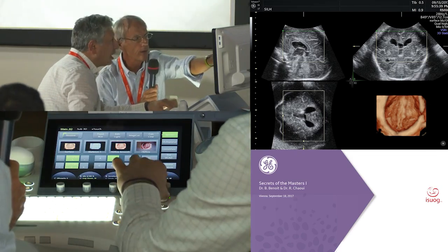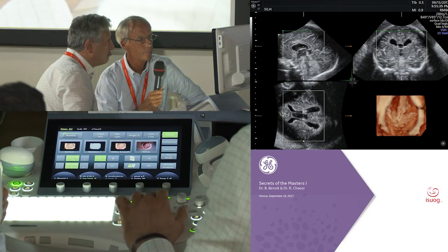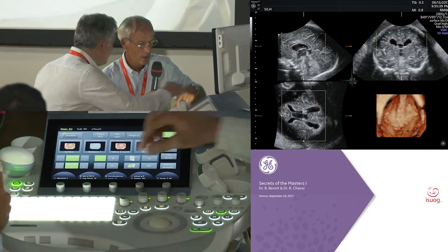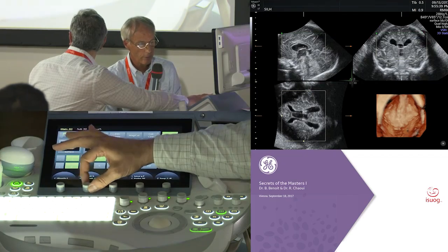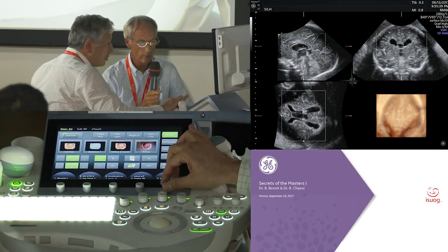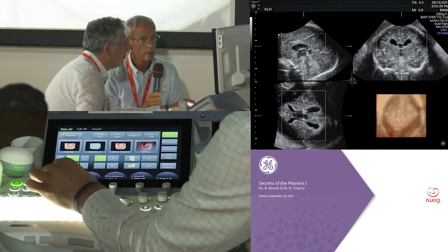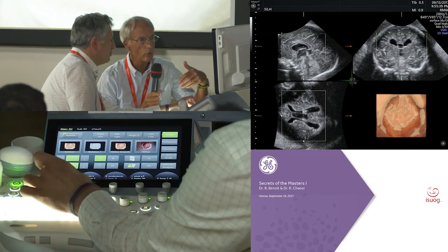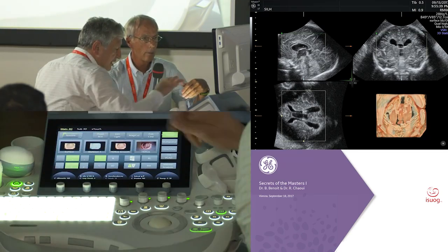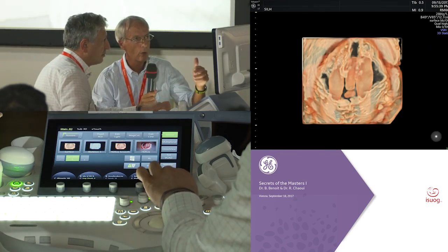Maybe we will increase the size of the rotate box. The Z to have a view from the top. Okay, and then you said threshold lower. Yes, lower. Reduce it completely to zero. No threshold. And silhouette, transparent, reduce that. Silhouette, increase it. How much? High, to max. We will try with the maximum. Is 100 maximum? Yes. And you were saying you play with the gain. And now what you can do, just scroll inside.